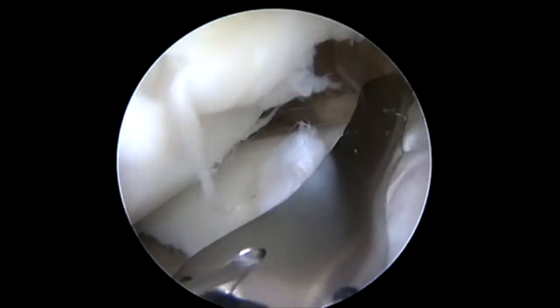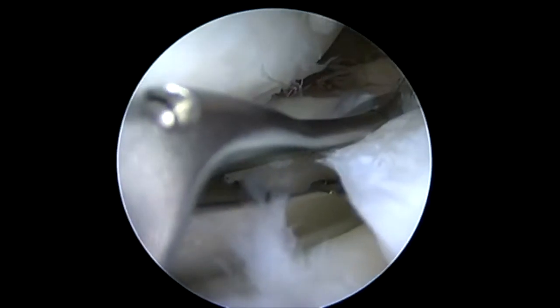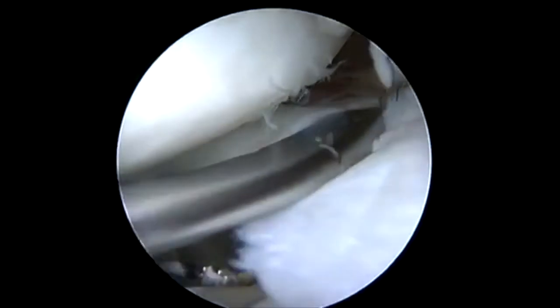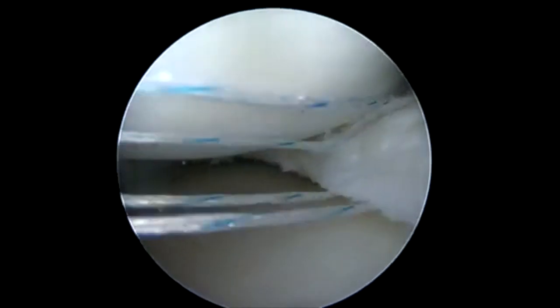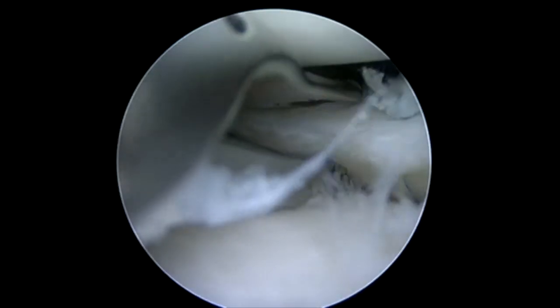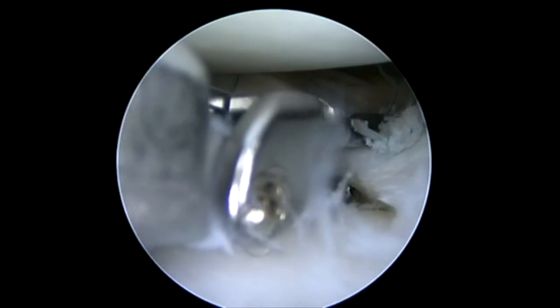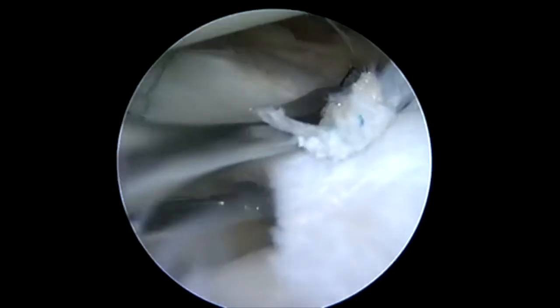Now we're back onto our posterior horn of the same meniscus. We're working through the lateral portal, visualizing medially. I'm taking great care to ensure that I've got a good grasp of the meniscus to get my suture placement where I want, to avoid the meniscus from sliding out of the jaws when I push my needle through. You can see how I'm getting a good firm grasp on the meniscus before trying to extend my second needle — the first one's already passed.